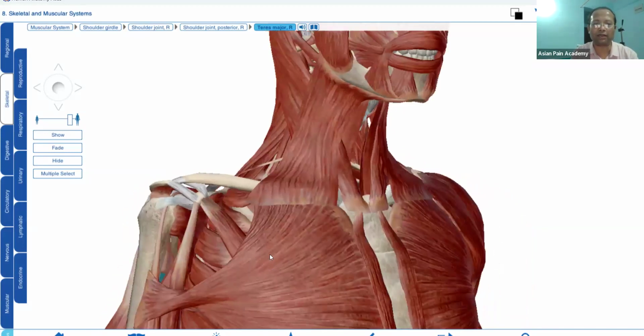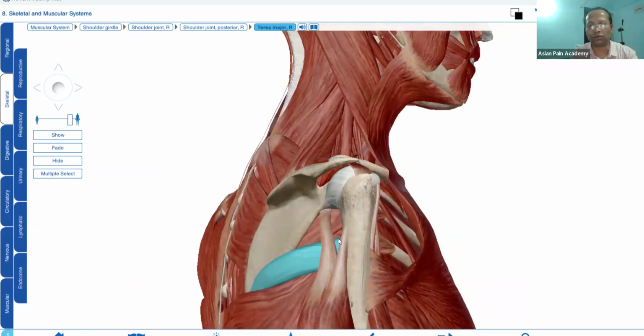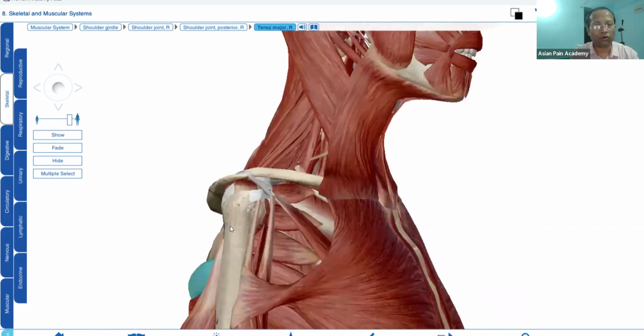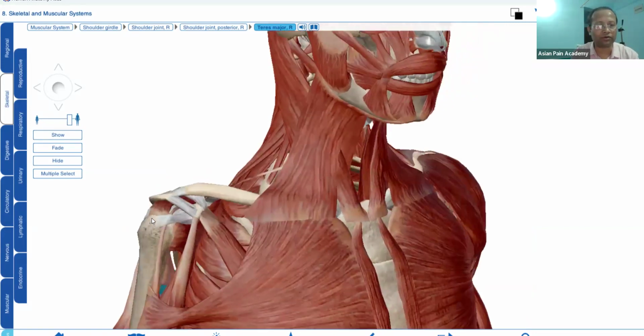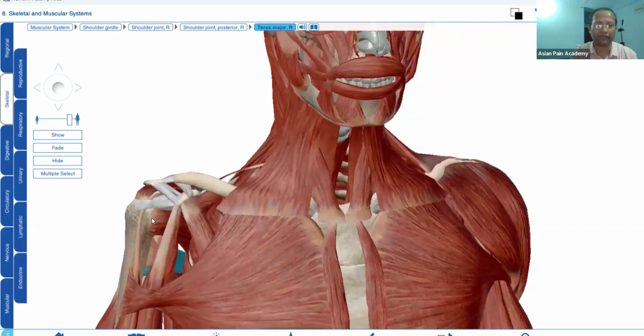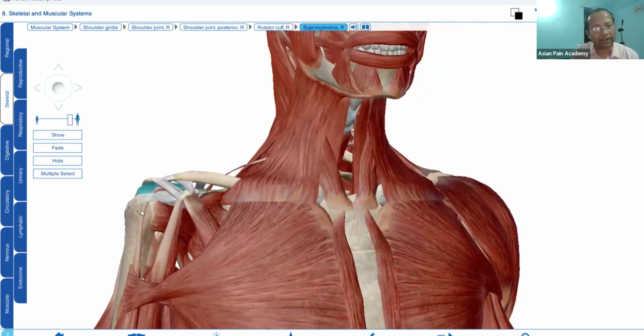While we are doing the ultrasound of the shoulder, we may see for some reason the teres major also. What another muscle is very much important here? We have talked about the four muscles of the rotator cuff, but when we are seeing this area, then we also see this biceps tendon.